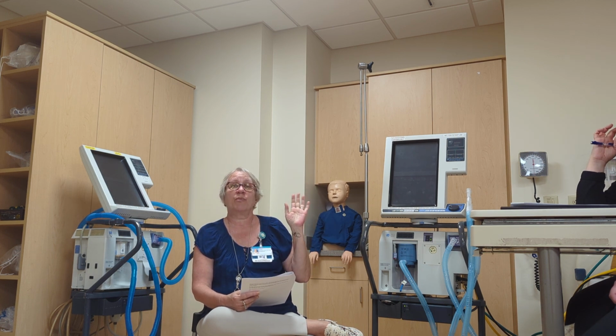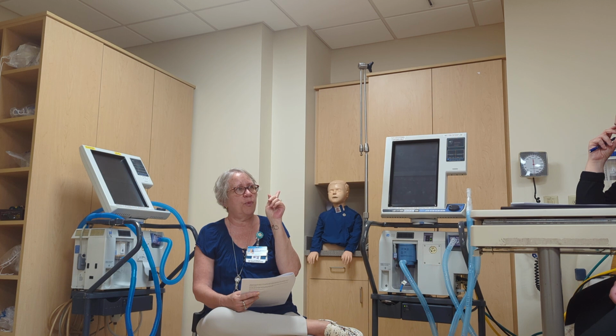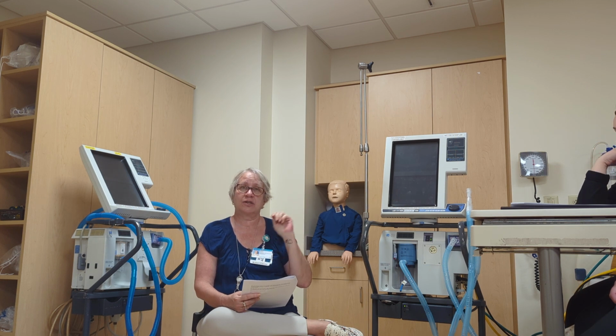And then I'm going to do my compliance calculation. That is step one, and you do step one before you put it on a patient.